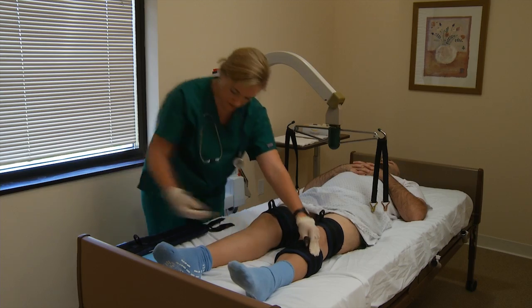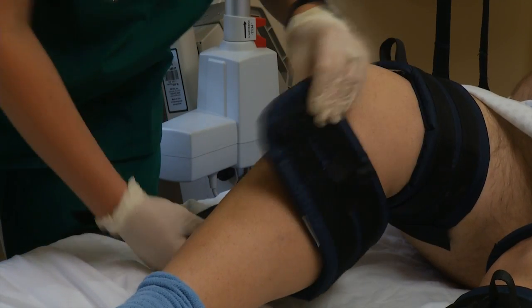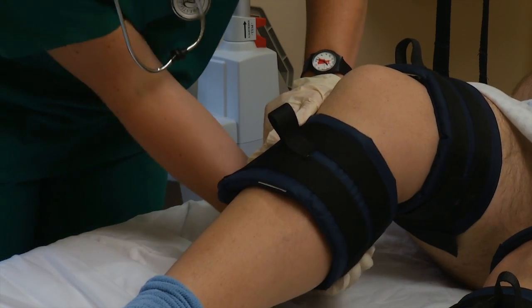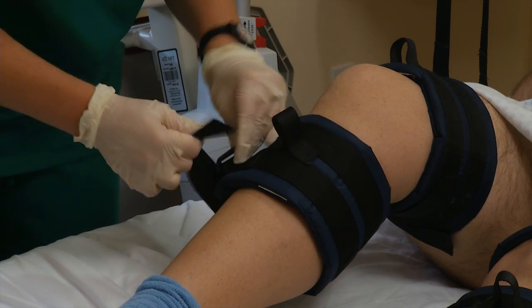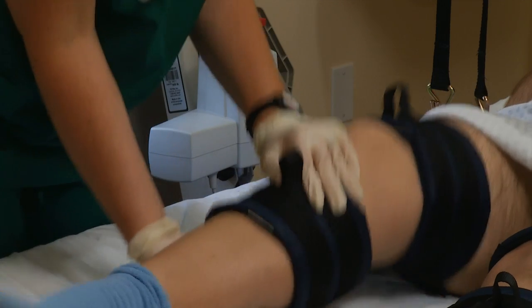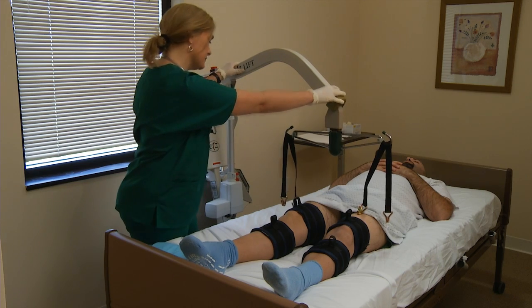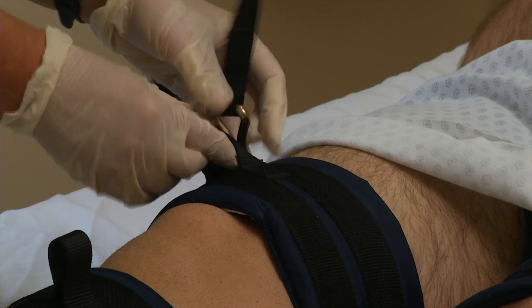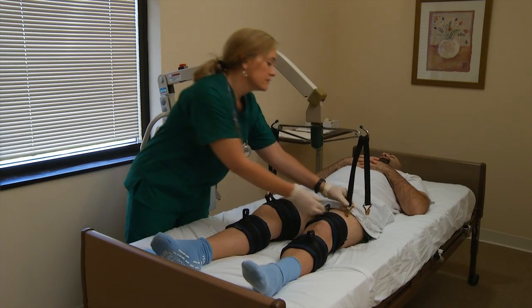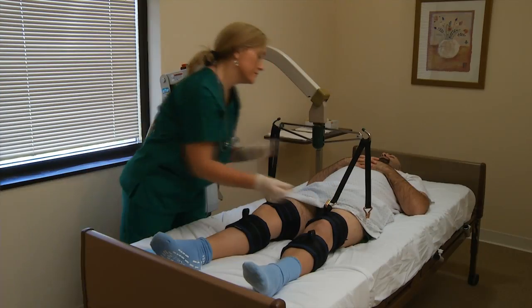The straps will be fastened with the loops positioned face up. As in the basic process, our demonstration is being done in real time. Once securely fastened to the legs of the patient, the caregiver will then position the patient lift over the straps, closer to the straps that are attached to the thighs of the patient. She will then attach the straps to the patient lift. The straps will be attached to the T-bar using strap adapters.